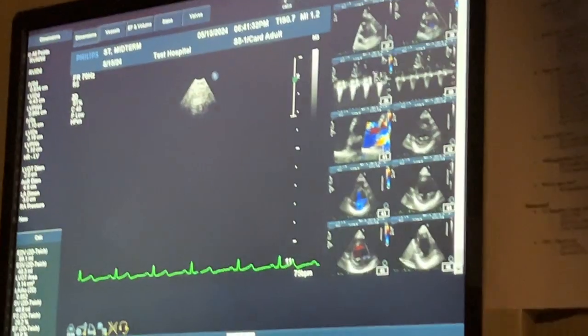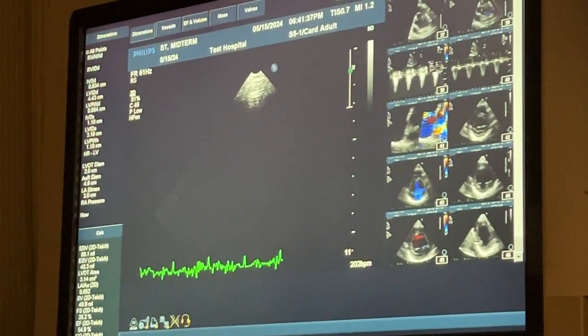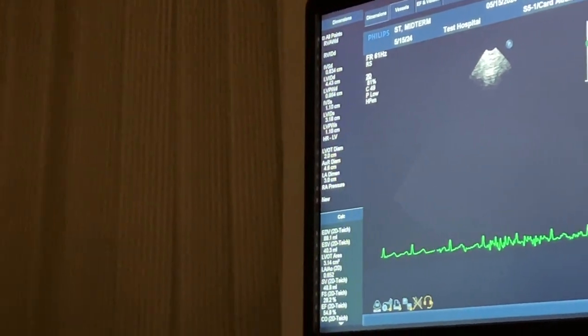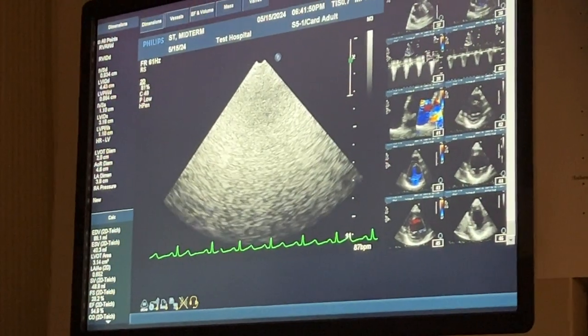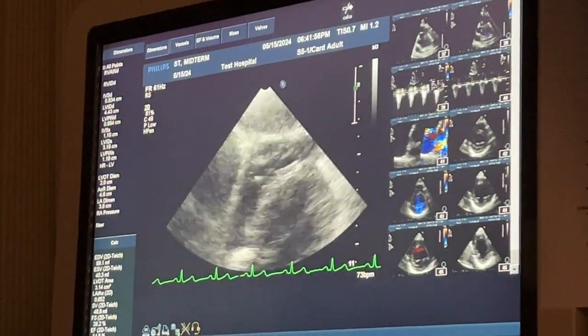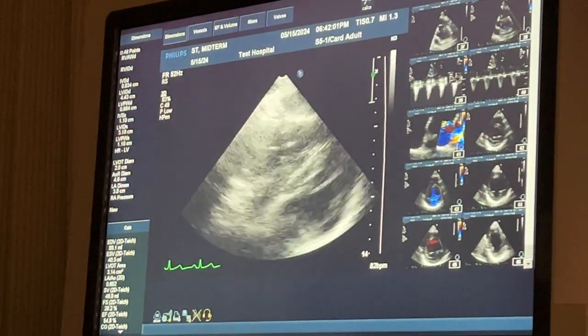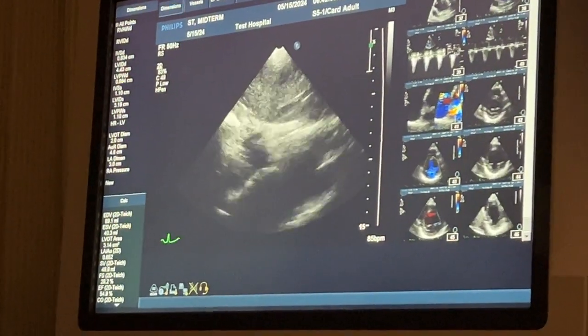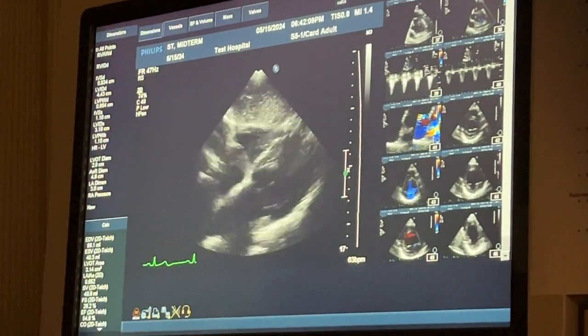So now you can lie on your back, and I will take some pictures at your belly level. You can just rest your arms wherever comfortable. I usually tell people for this part, you can put your feet up on the bed and bend your knees. Yeah, so you can get comfy. And I'll start at the spot in your belly where your ribs are.